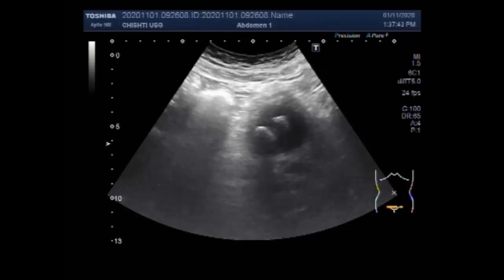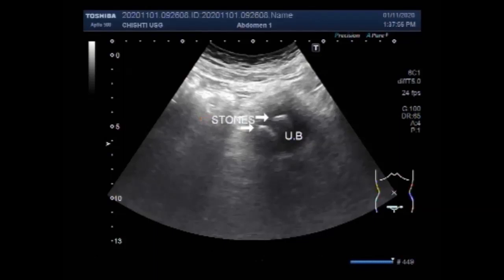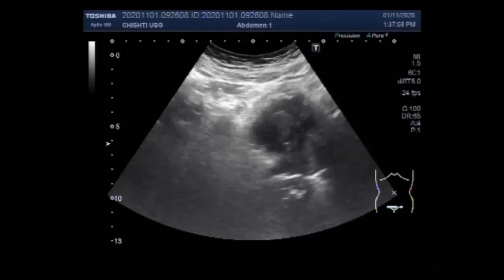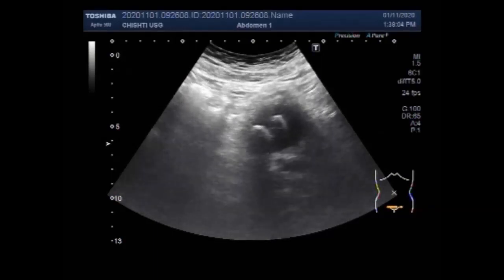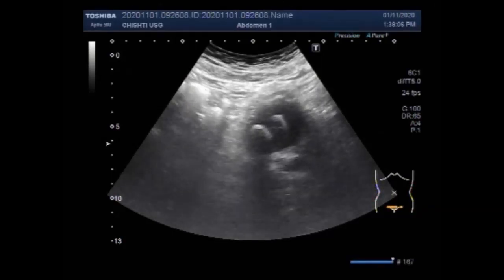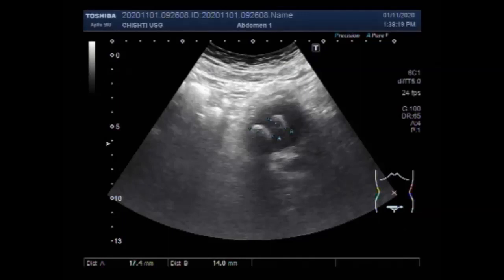Now you can see the urinary bladder, and it has two stones in the urinary bladder. Although the urinary bladder is not properly filled with urine, the patient couldn't hold the urine. The ultrasound was done as circumstances permitted, and you can see two large stones each measuring about 17.4 mm and 14.0 mm.